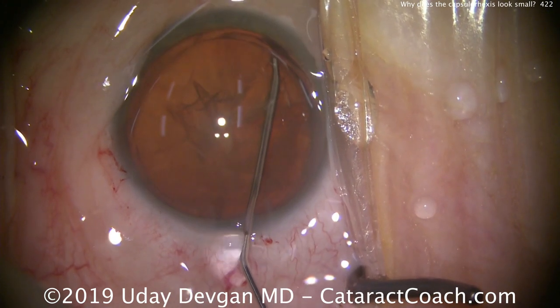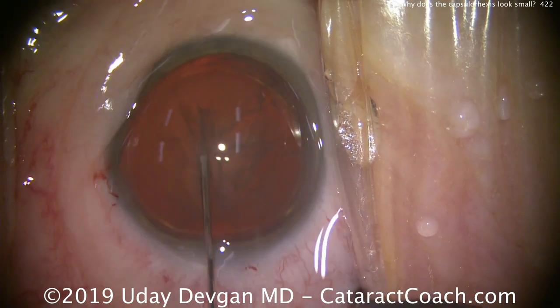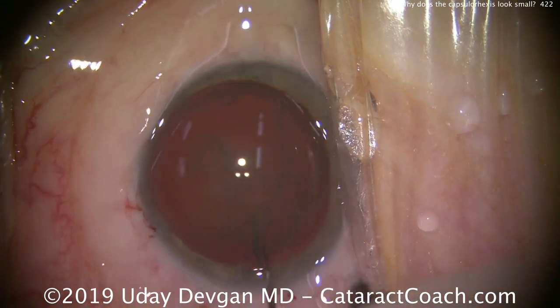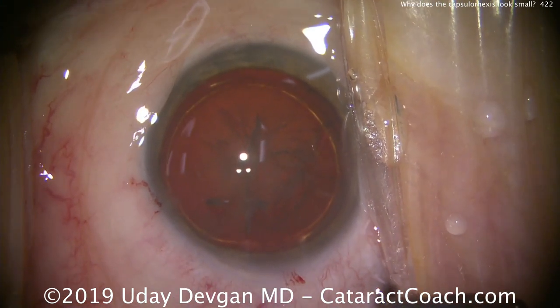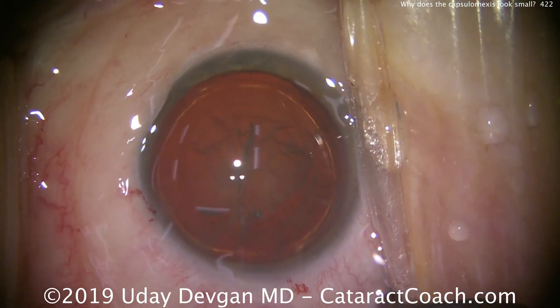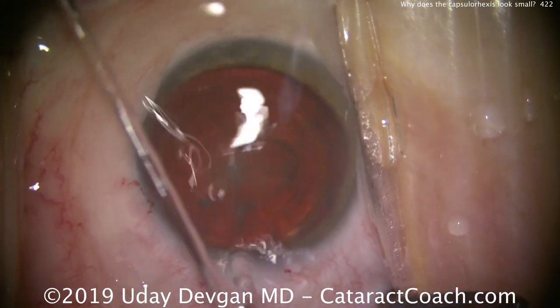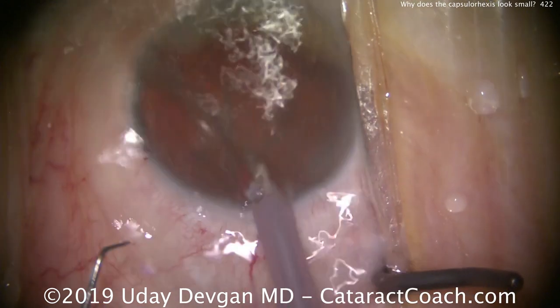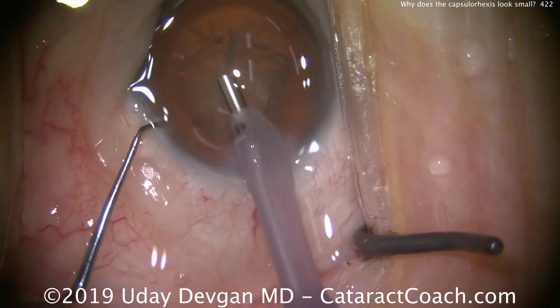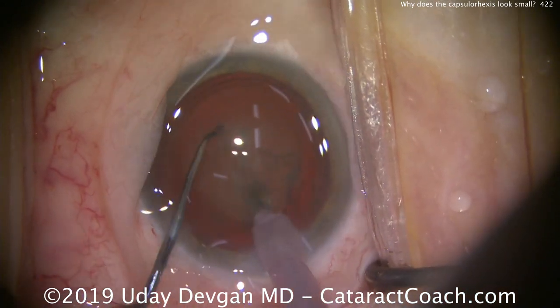This is an eye with an axial length of about 30 millimeters and a very large anterior segment. Again, the white-to-white corneal diameter is about 13 millimeters. The lens nucleus is also quite large. We did some hydrodissection and have rotated the nucleus. Because the capsulorrhexis is five millimeters and the diameter of the cataract is much, much bigger — probably 10 or 11 millimeters — we'll need to chop this into pieces to take it out of the bag.